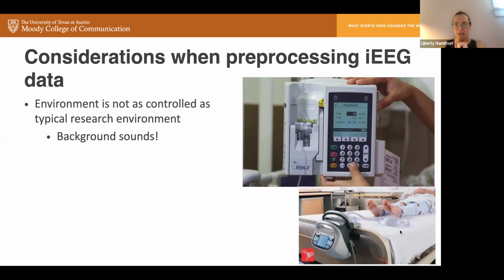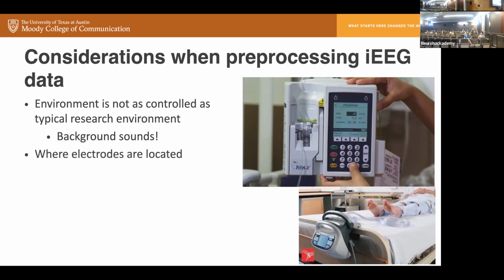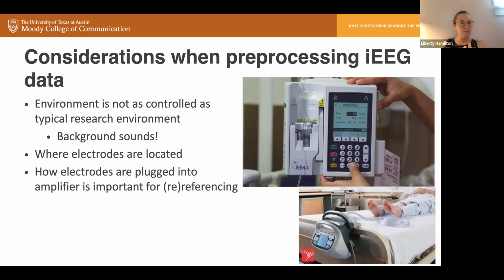One more thing, sorry, to say about background sounds. A lot of the patients also have these calf pumping devices that are meant to prevent blood clots, but they make quite a bit of noise, both in terms of their sound and also electrical noise. And same thing with some of the electronics around the bed. So the people who are collecting the data have to make a big effort to minimize these sources of noise. But if you're coming into this naively and looking at shared data, you should be aware that sometimes if you see something weird in your data, it might not be a brain thing at all. It could be something else going on in the room. And so I think thinking of ways of annotating those sorts of issues and actually sharing that would be very, very helpful.